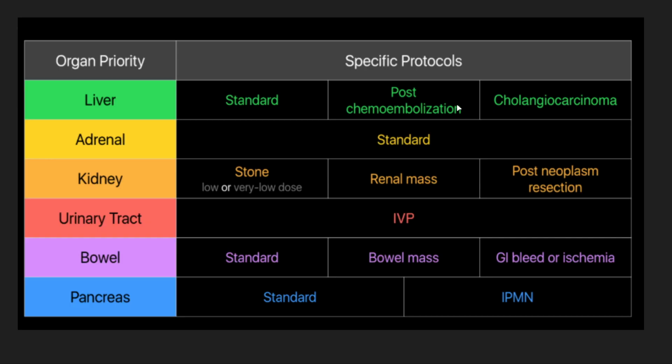They also have the same end result, which is you as a radiologist or you as a referring provider will request an image. The request will be sent to the radiologist. The radiologist will determine the protocol via WhatsApp or via Google form or whatever, and he will send this protocol to the technician to do it for him. Okay? So obviously any protocol will have an organ, and every organ has a protocol that basically summarizes the phases.